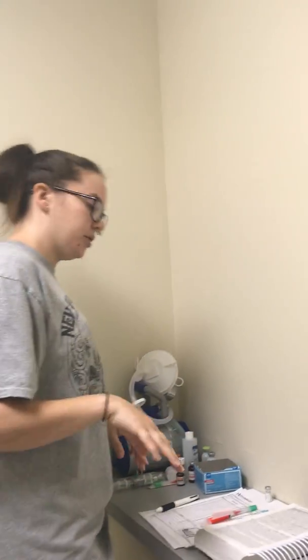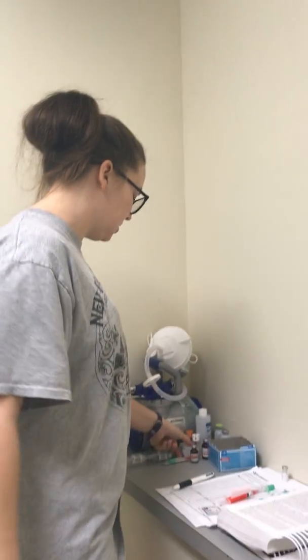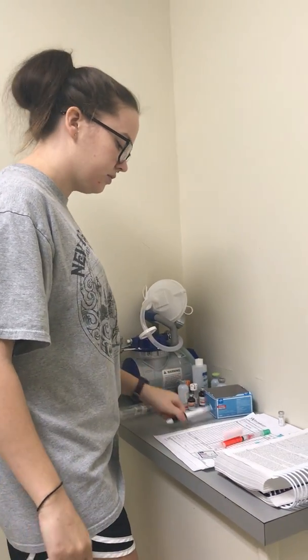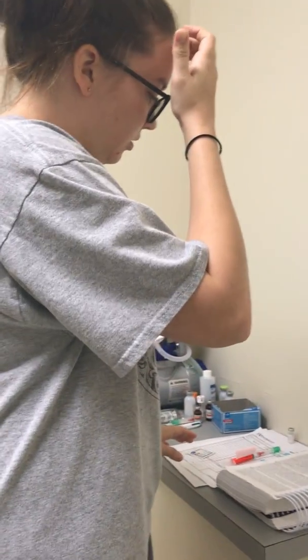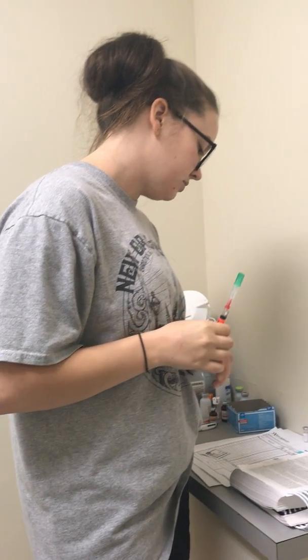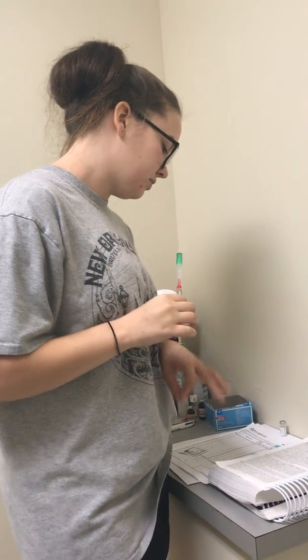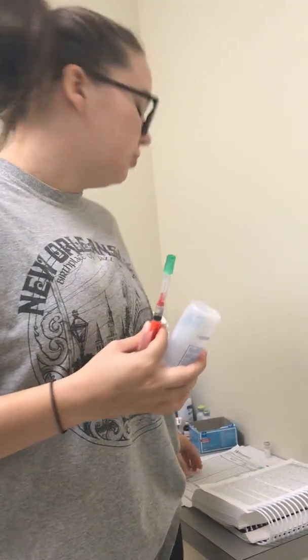Okay, so everything's appropriately labeled. I would put all my equipment up that I need to discard. Okay, then I would get my syringe. Then I would head over to my patient's room.